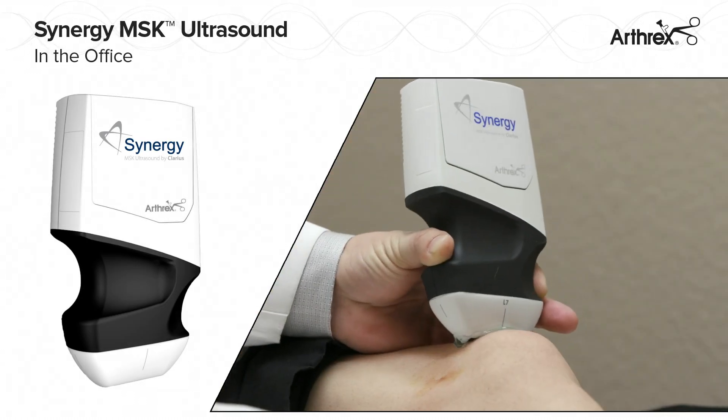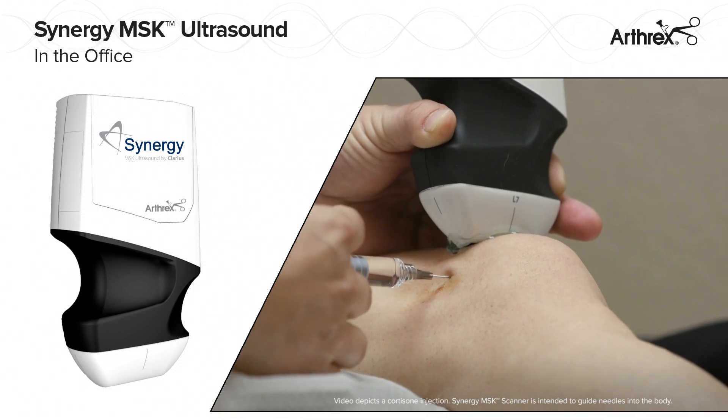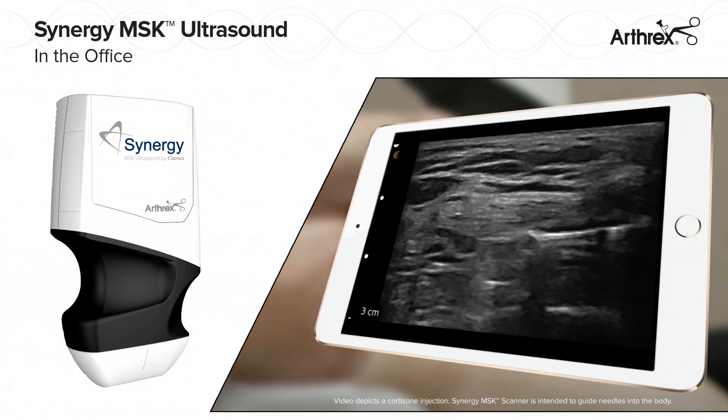The Arthrex Synergy MSK Ultrasound is a high-resolution, wireless, handheld ultrasound scanner that seamlessly transmits real-time images to an iOS or Android mobile device.